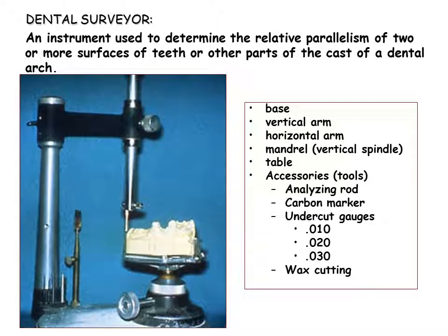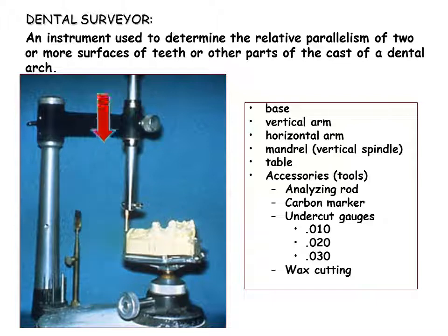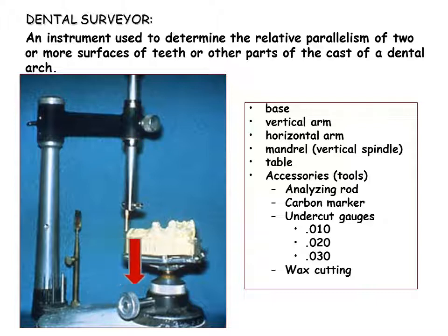The items you will need to survey the cast are the surveyor, surveyor table, and surveying tools. The surveyor consists of a base or platform, vertical arm, horizontal arm, and a vertical spindle or mandrel. The vertical spindle moves up and down and is secured with a lock knob. The cast is secured to a swivel table with a locking pin. A small collet on the vertical spindle is used to secure the analyzing rod, undercut gauges, cutting tool, and carbon marker.